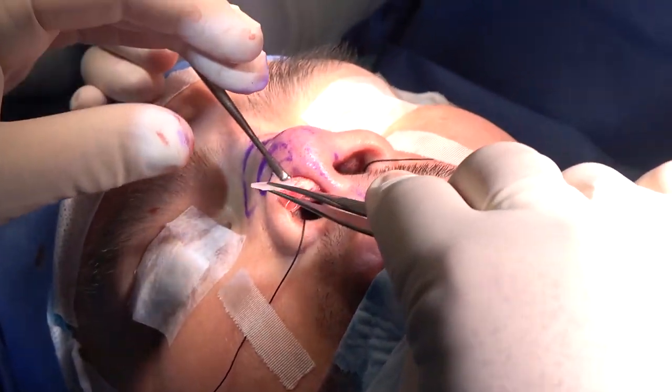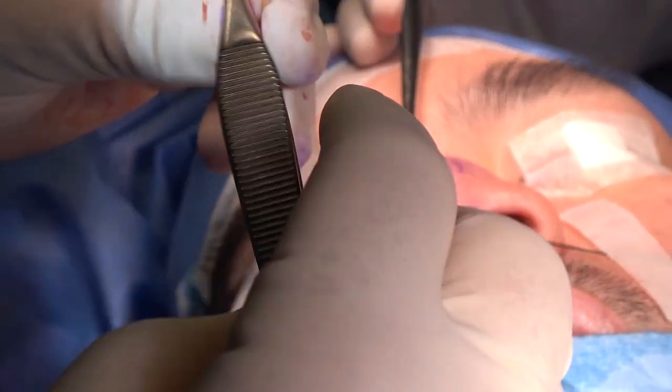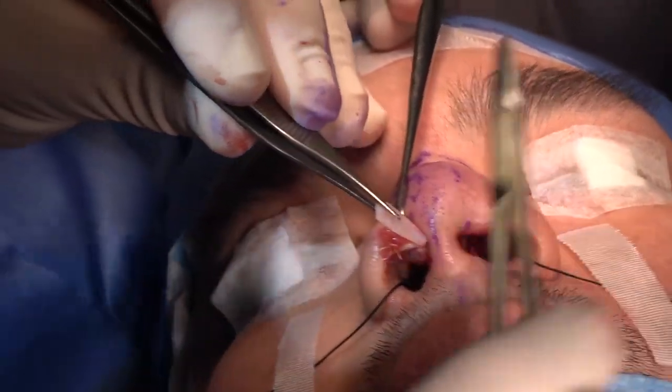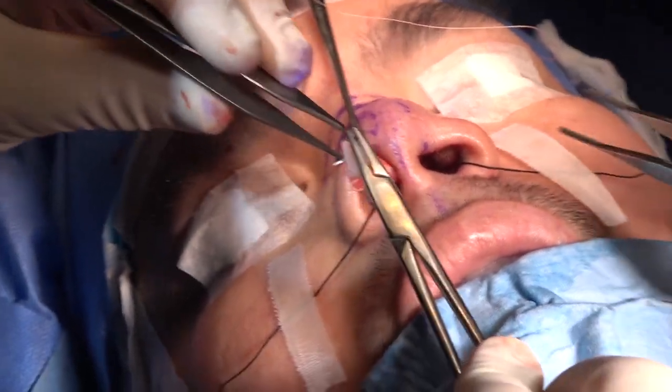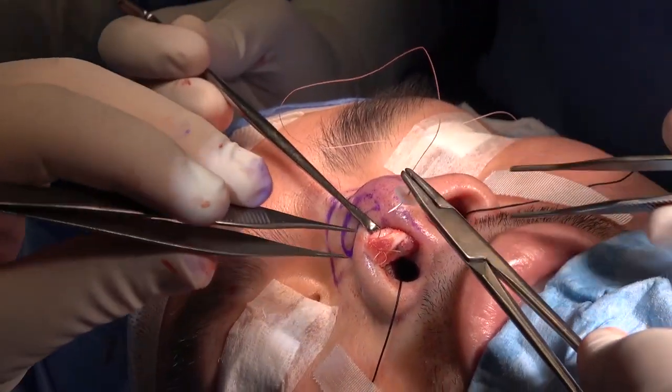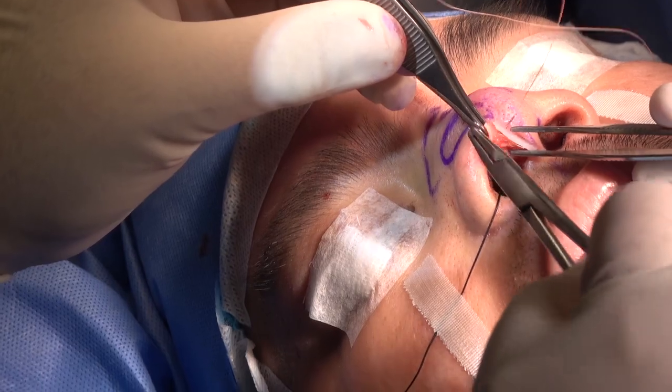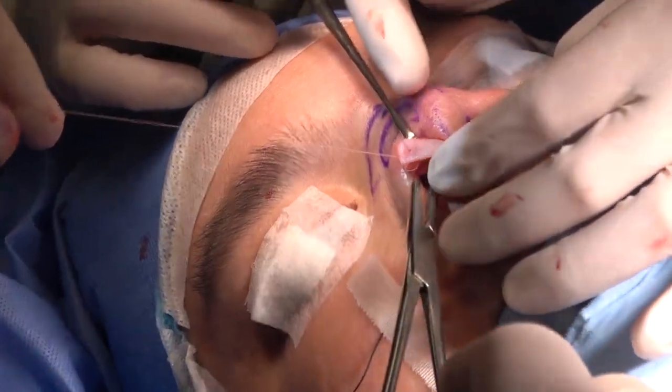Let me switch that straight away. Need multiple grafts because we need to fill. You need to fill this area. Can you push it please forward? Forward. I need to fill this area. I need to fill this area there.